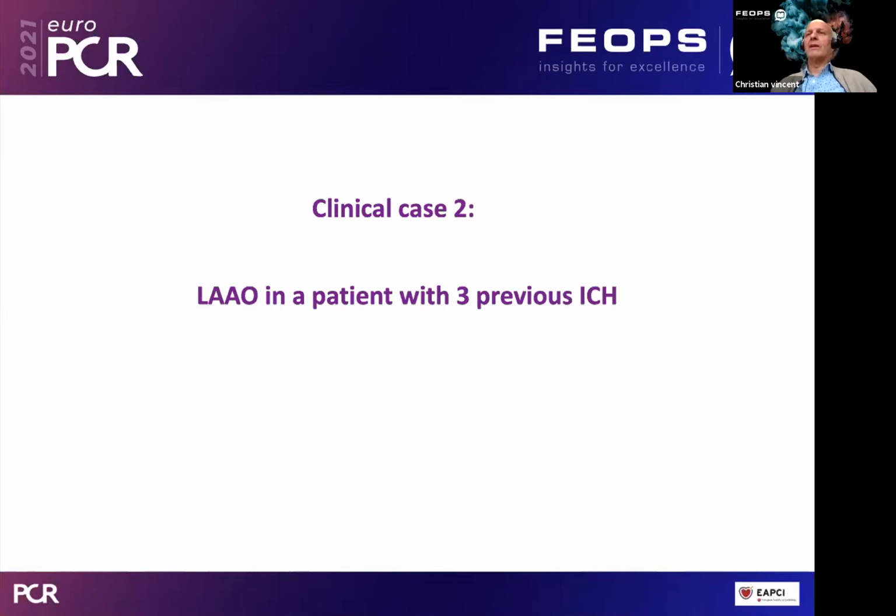Thank you, Christian. So okay, this is the first question. There are also many other questions. One of the questions we received, more a comment, is that the CT in general for analysis does not necessarily reflect the current status during the implantation.